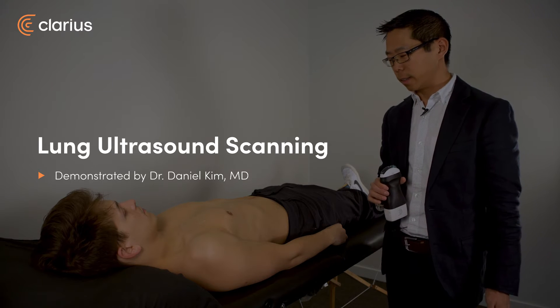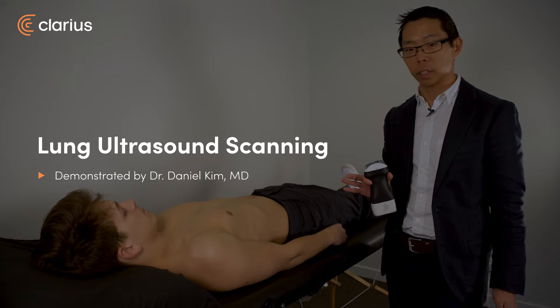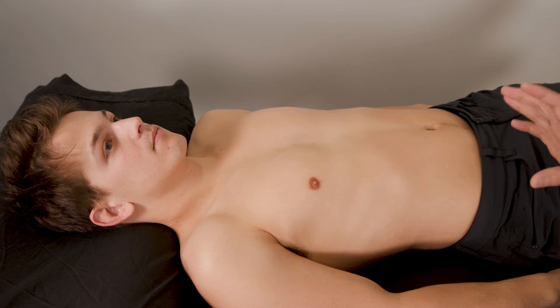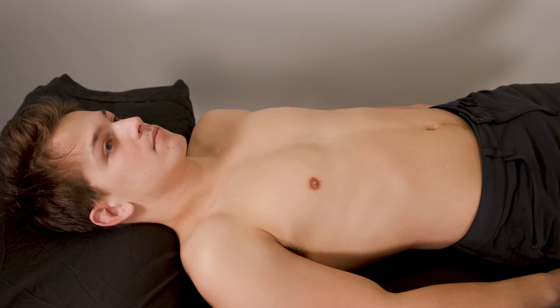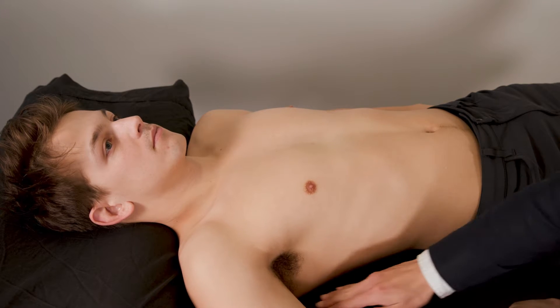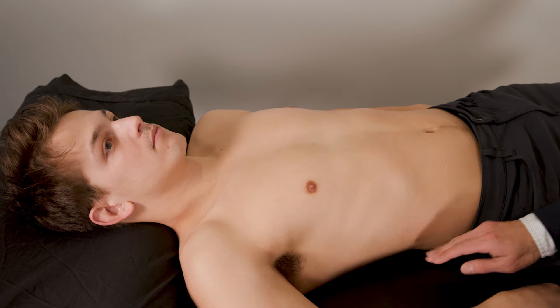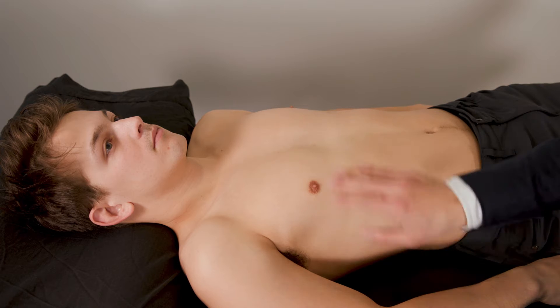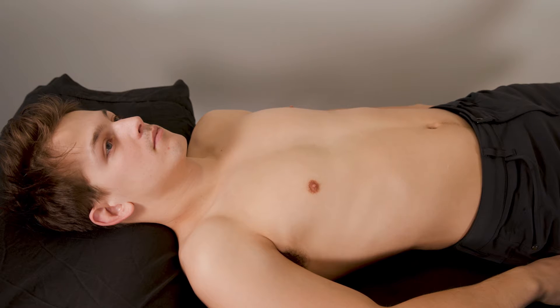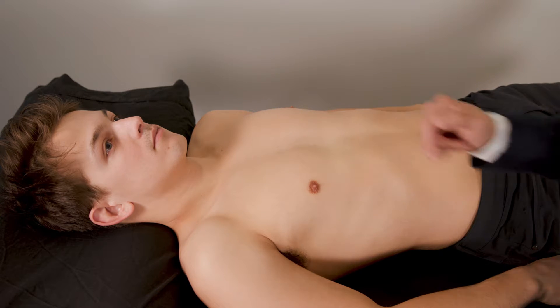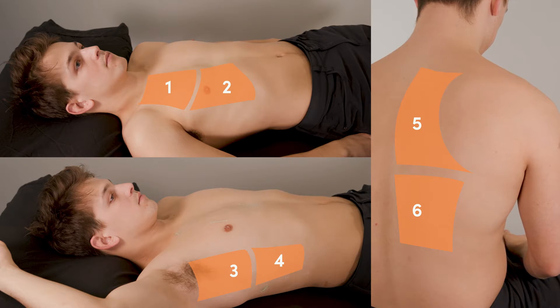For lung ultrasound scanning, the idea is to try to interrogate as much of the chest as possible. Therefore, we divide each hemithorax into six zones. The landmarks we use are the anterior axillary line and the posterior axillary line, which delineate the anterior chest, the axillary chest, and the posterior chest. Each area is divided into an upper and lower zone, providing six different scanning areas.